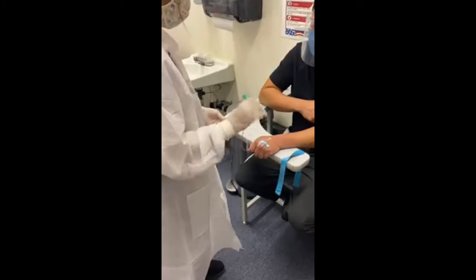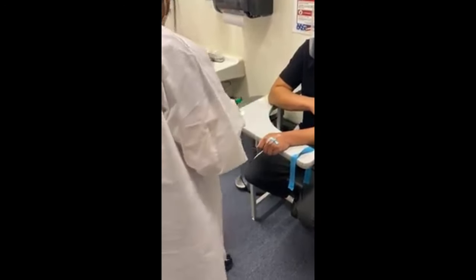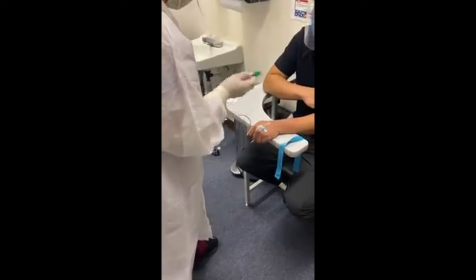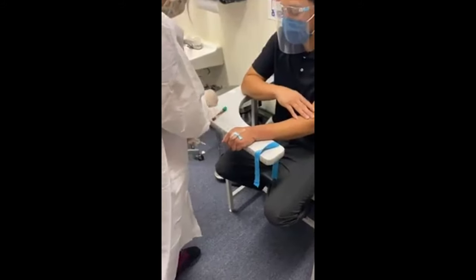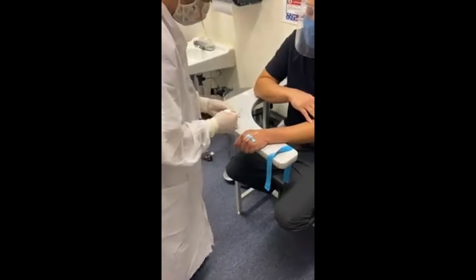Take out the tube. Nice. Okay, invert. Okay, perfect. Yeah, set aside is fine. Good. And this. Yep. And then we'll practice with the button.